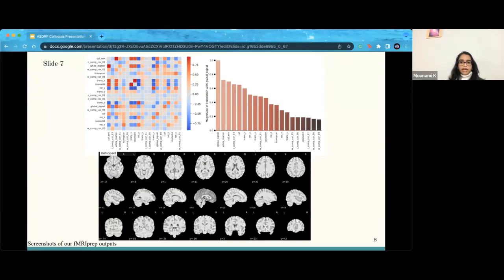On the bottom is an anatomical pre-processing step called spatial normalization. Here, the patient's brain is essentially mapped onto a reference or template of previously collected brain scans that were compiled into an average brain template, which, the one we used, was MNI152.